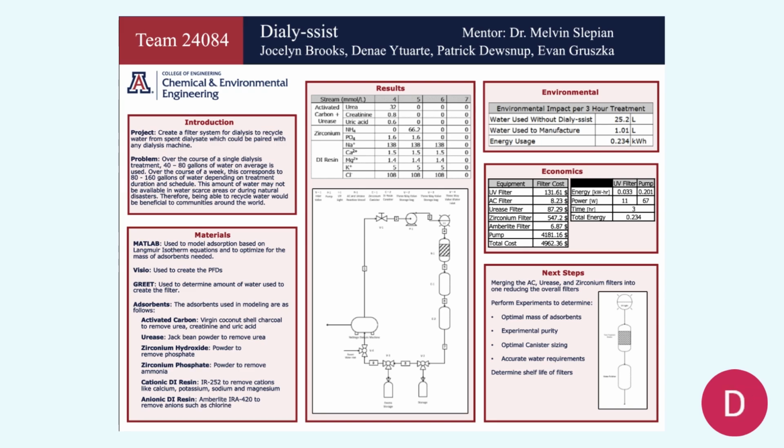In conclusion, we have theoretically created a 3-filter system in order to recycle water from spent dialysis. In the future, we wish to do more experimentation just to solidify that our system actually works with actual spent dialysate.